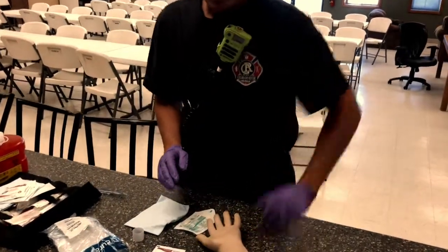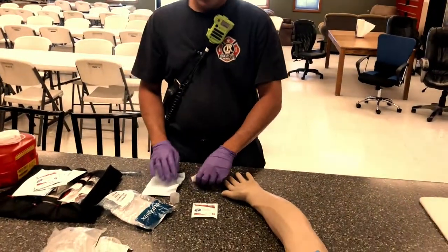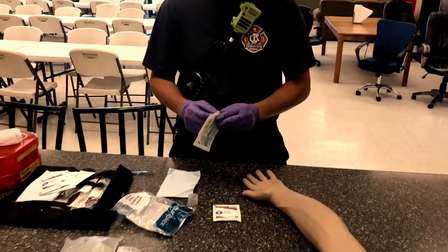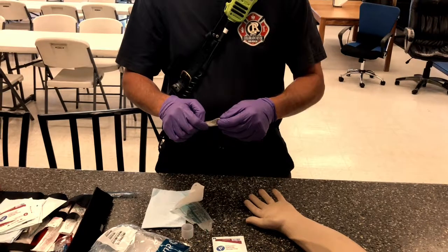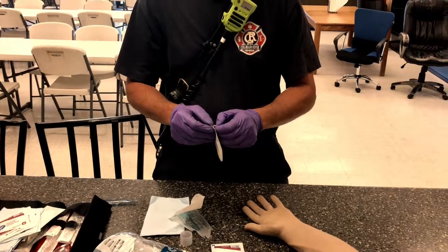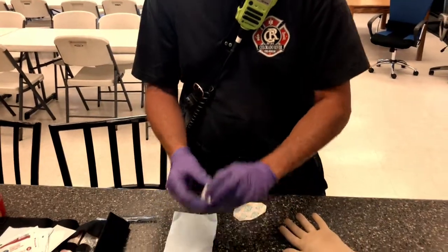Okay, while the arm is being filled with blood, we get the rest of our IV set up. Start with our Tegaderm. Open it out of its protective barrier, and just pull back a little so it's ready for you. We're going to get our tape ready to go.